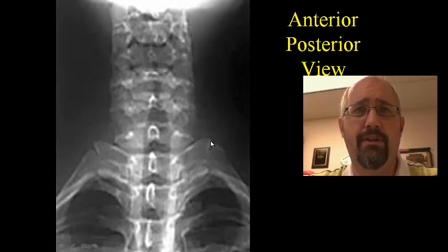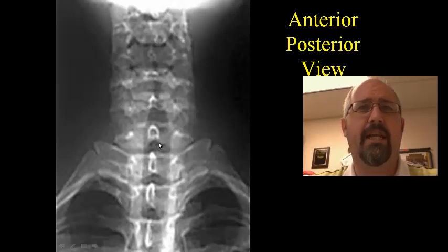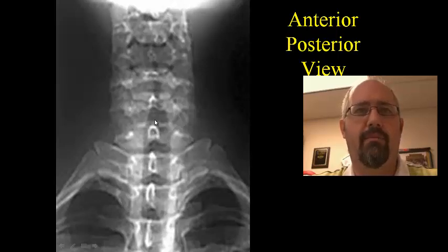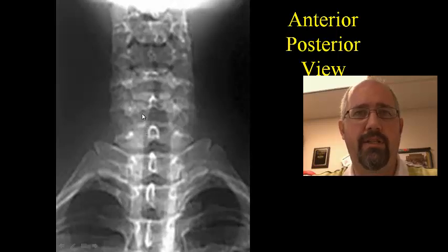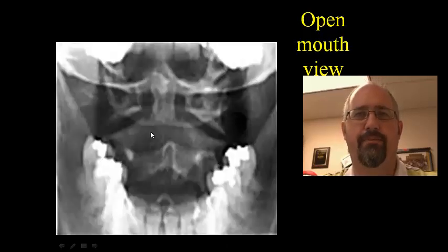Looking from an anterior to posterior view — it's a bit fuzzy, pretty hard to see in some ways — but you can just see the definition between the vertebral segments and where the discs are going to be. We're also looking right at the spinous processes in an end-on sort of positioning.